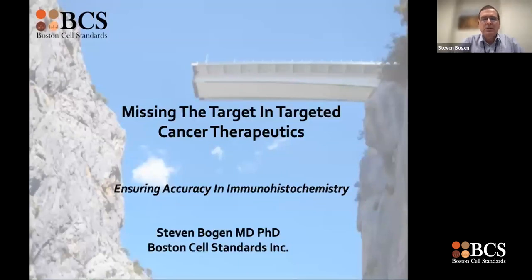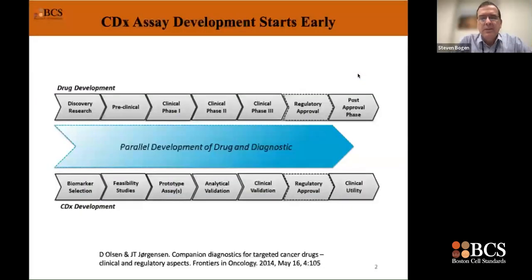So in this seminar, I'm going to describe how you can avoid the pitfalls of IHC in the context of companion diagnostic assay development in association with drug development, and use these new tools, immunohistochemistry calibrators, to your advantage. The presentation is aimed at industry scientists working across the drug development spectrum because companion diagnostic assay development really starts early and evolves with time.